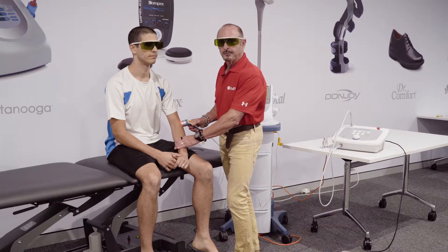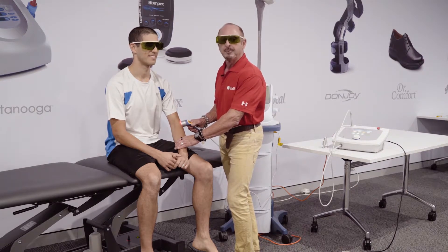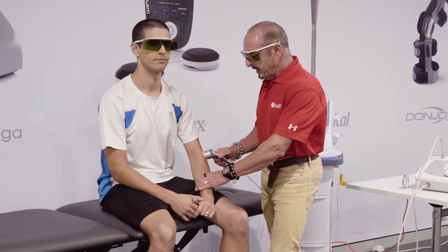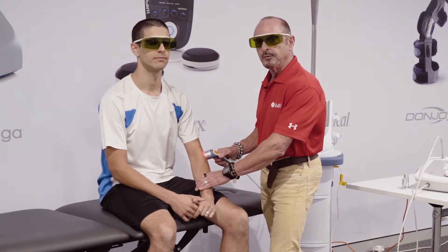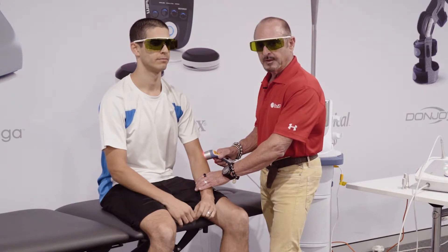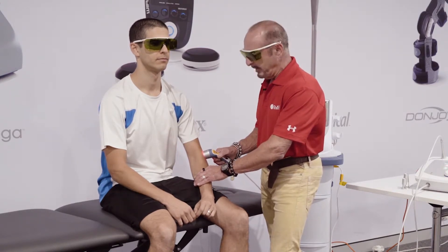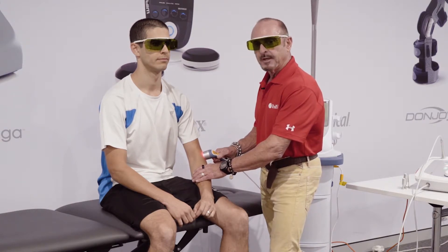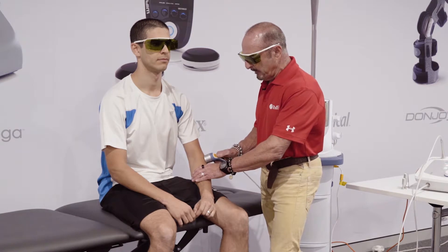I like to tell patients not to look at the light — they're like moths, they go right to it — but we have eye protection on. Each interval with this desired dosage is somewhere between 30 to 35 seconds. It's a static treatment over the size of a playing card; we just move it a little bit and begin again.